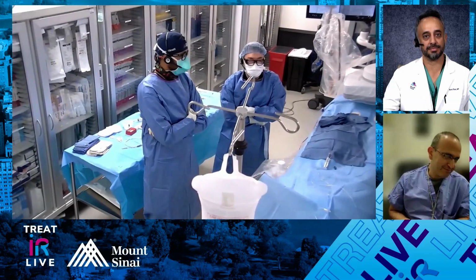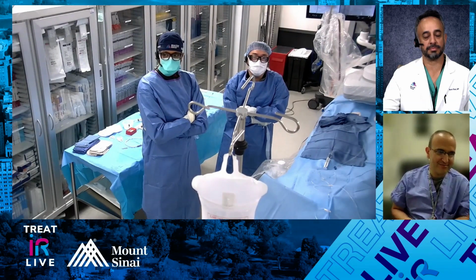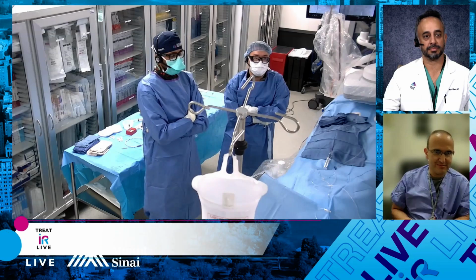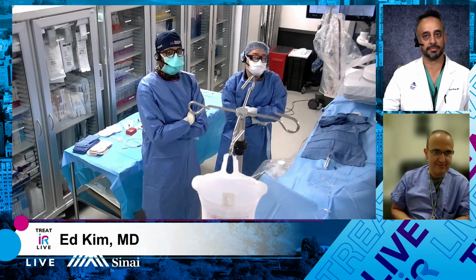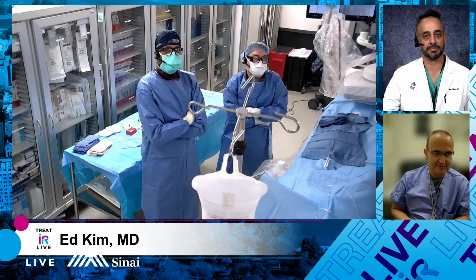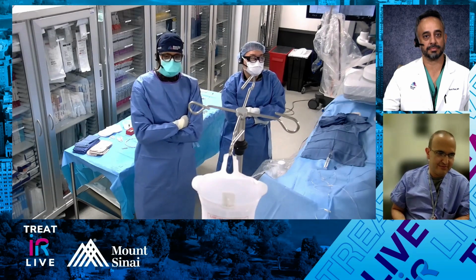We have our whole team here. So our technologist is Giselle. Our nurse assisting us is Krizia. And we have our anesthesiology team here as well. Liz is with us. And our PGY6, Sid, will be presenting the case.